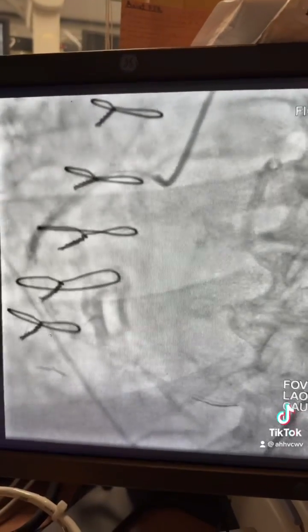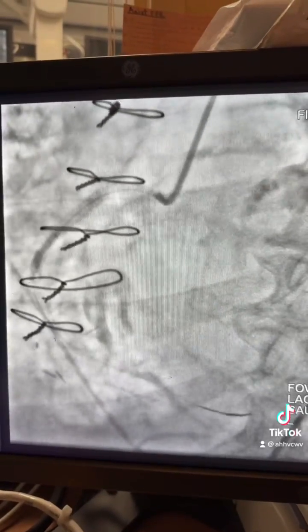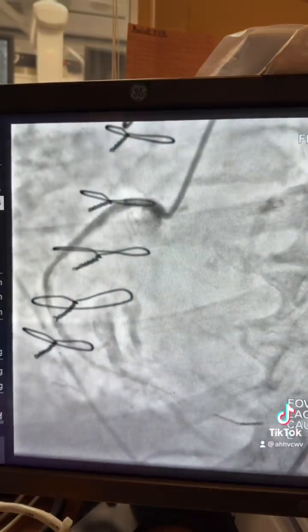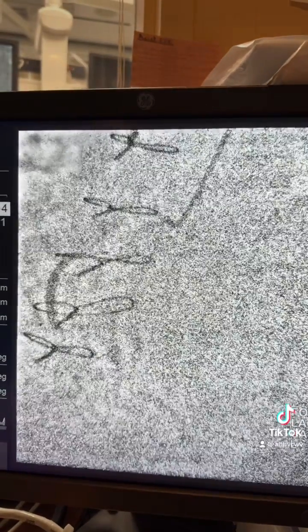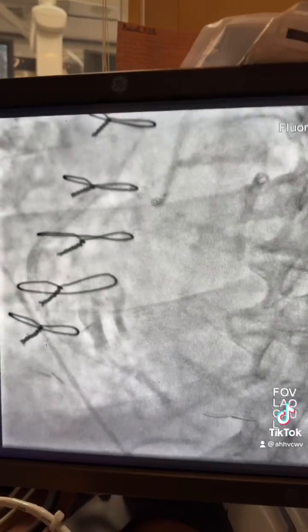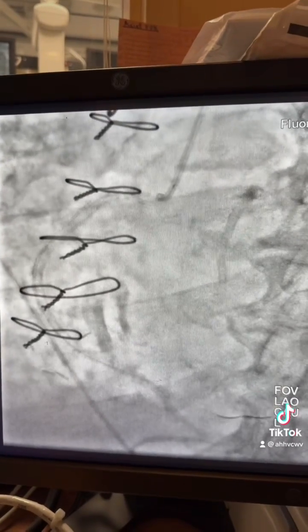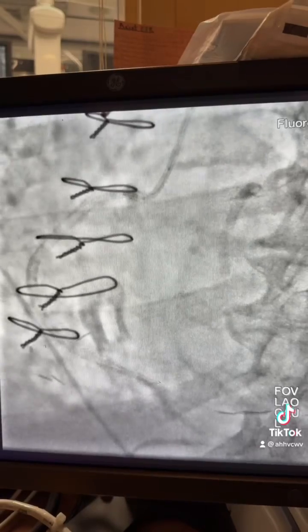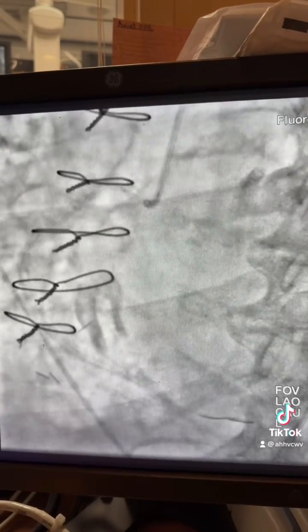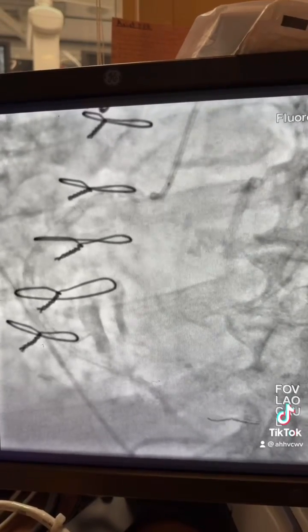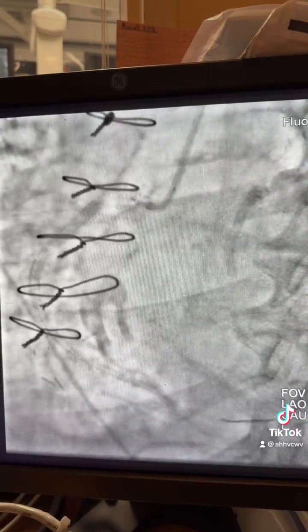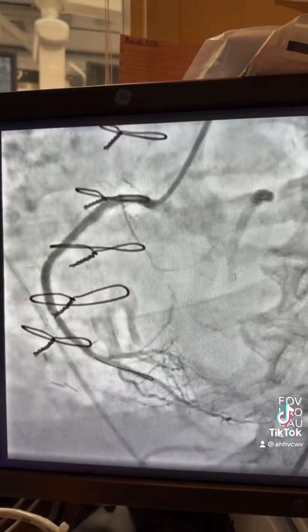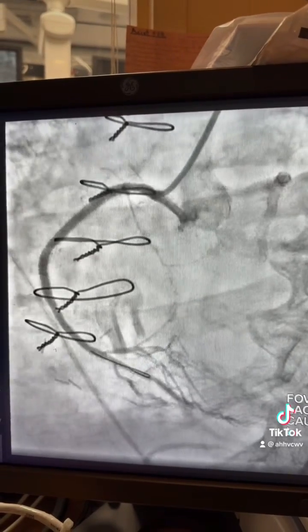Then you continue the intervention: lithotripsy in the mid RCA, then stent the mid RCA at high pressure. Before pulling the balloon, you can advance the catheter over the balloon inside the stent — make sure the pressure is good and there's no damping. And here's the final results.